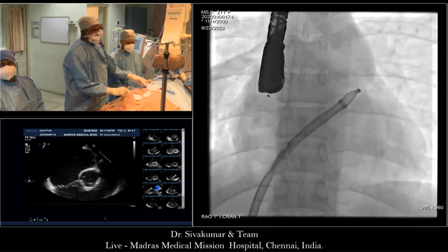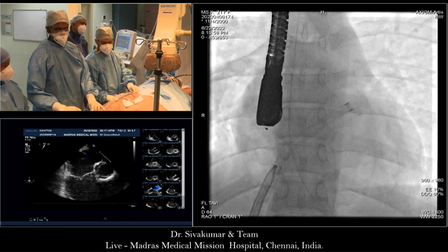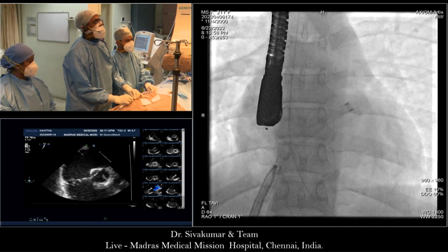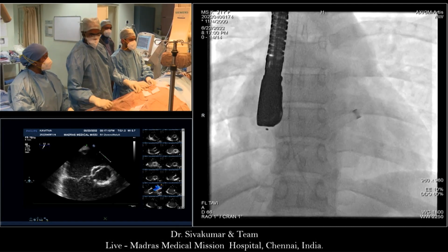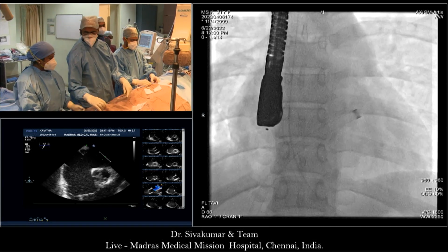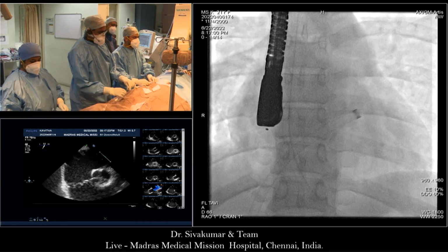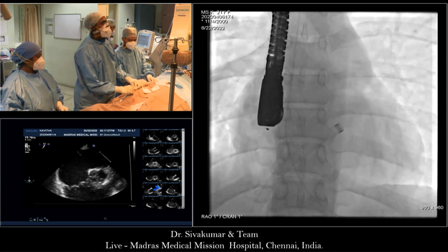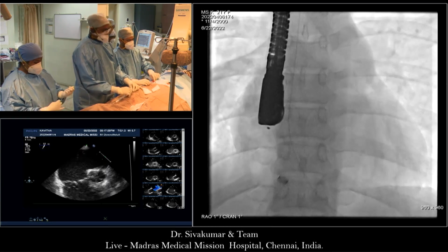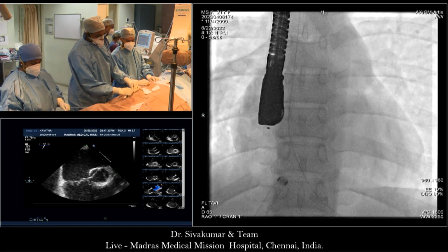You may have to pull back to the middle of the spine before you go into the left upper pulmonary vein. Yeah, way back. I will again get it with the catheter. I think that's really safe. That's a very safe practice, not to poke around, to just take the time. That's a really good practice, Eva. Well done.